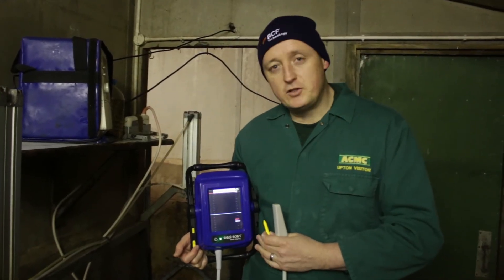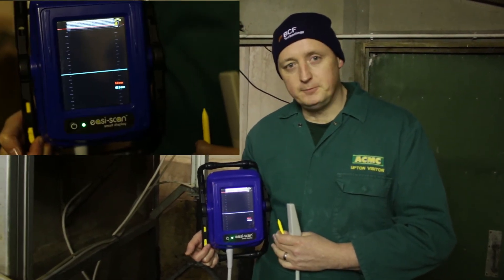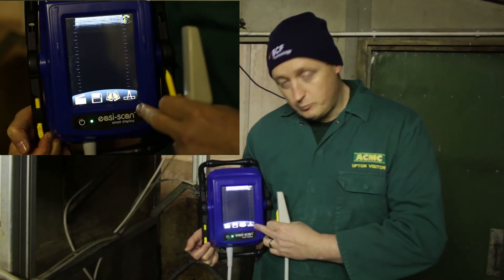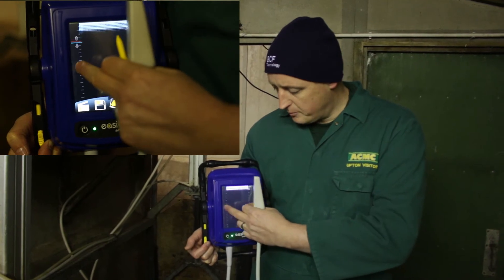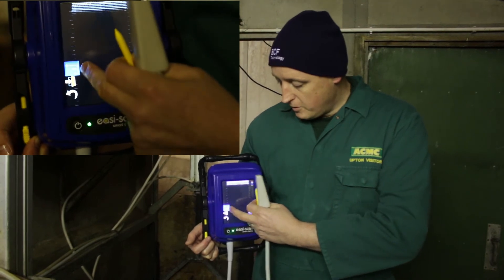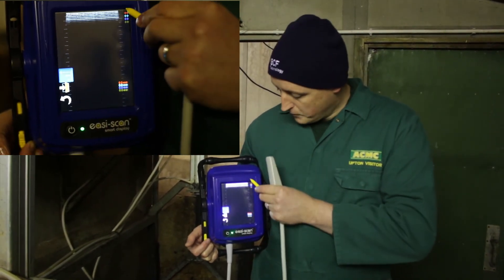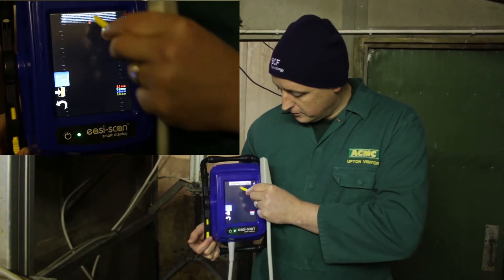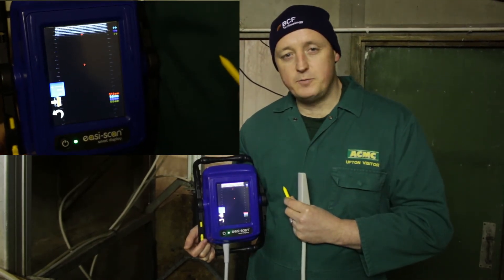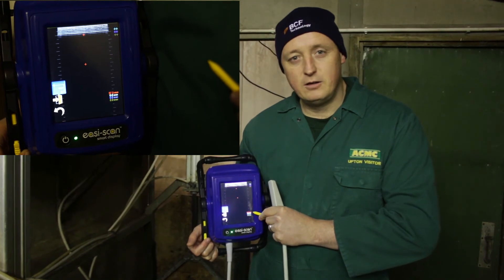In this situation we've achieved the image that we require of the animal. We've pressed the save button, and then to use the calipers we simply press the screen, press the caliper button, and select calipers. We then toggle between the options of measurement in terms of what we want to measure, and simply take the red little crosses — the calipers — to the corresponding anatomy.